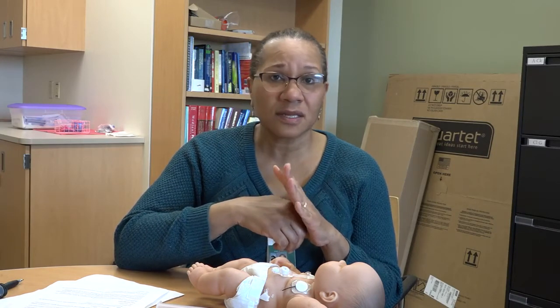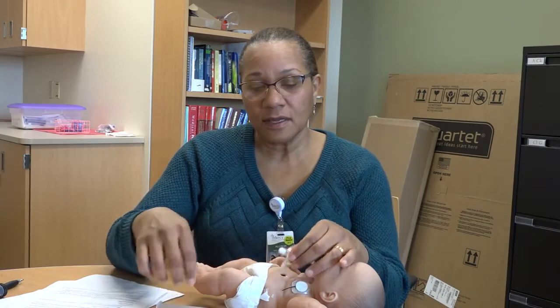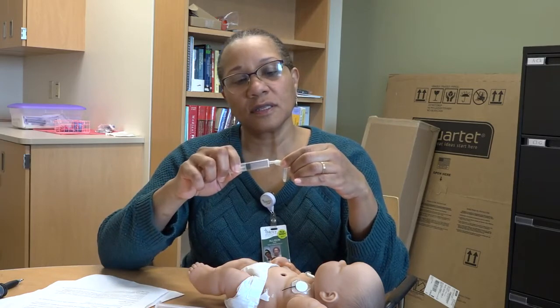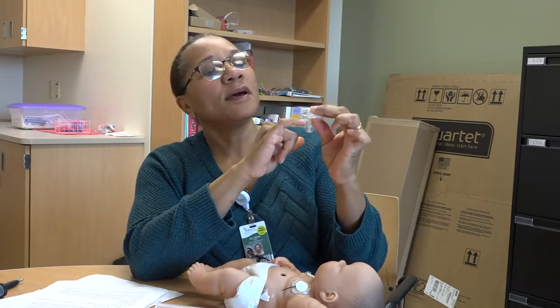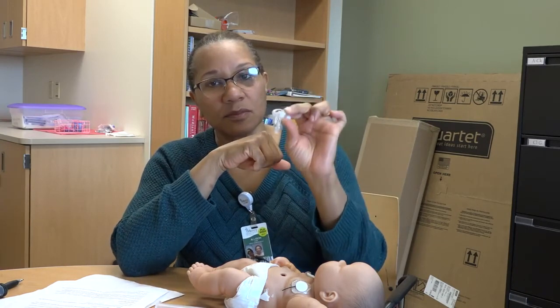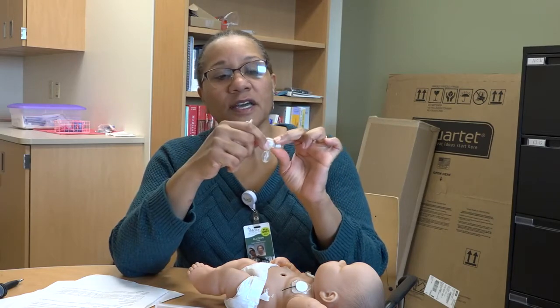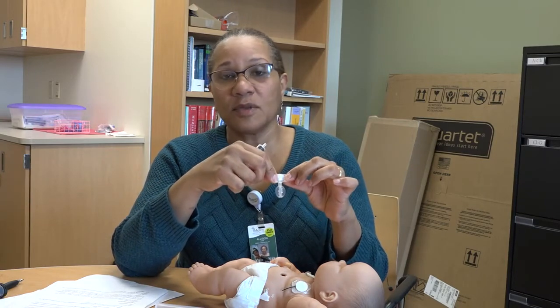Then one of the other things that can cause leakage from the stoma is if there's been any loss in weight. Usually that's a late sign. Most often these babies are getting weight checks frequently, and so you know when they're losing weight. But if there is a loss of weight, then you're going to see an increase in the length. And instead of seeing a small amount of your white line, you may be seeing quite a bit more of your white line. So once again, this balloon is going to get more loose. It's not going to fit as snug as it did previously. You're going to have more leakage, and that can be because of weight loss.